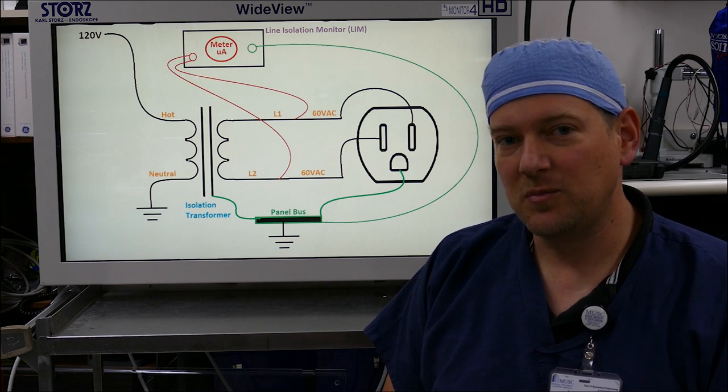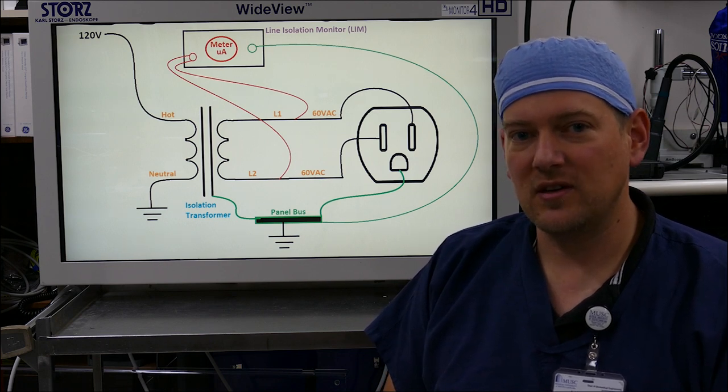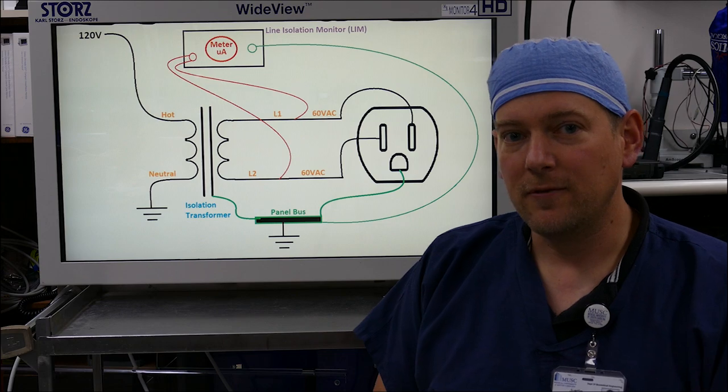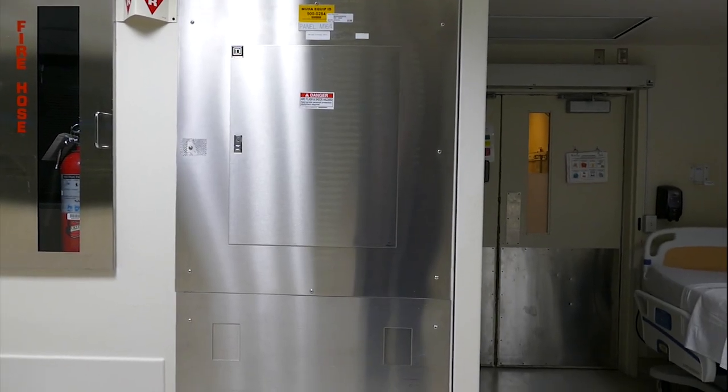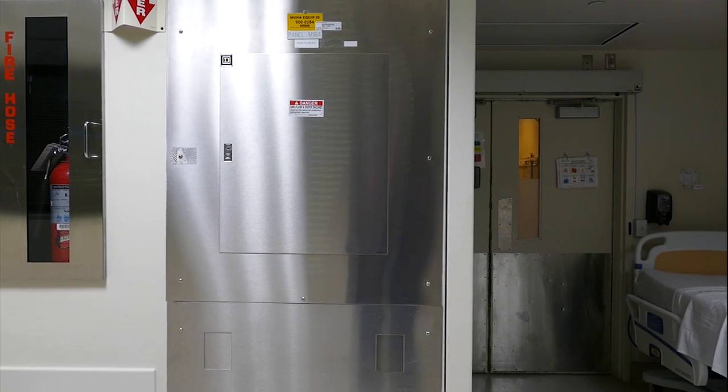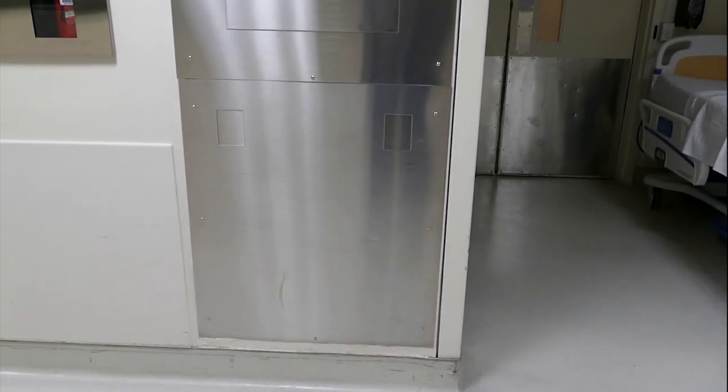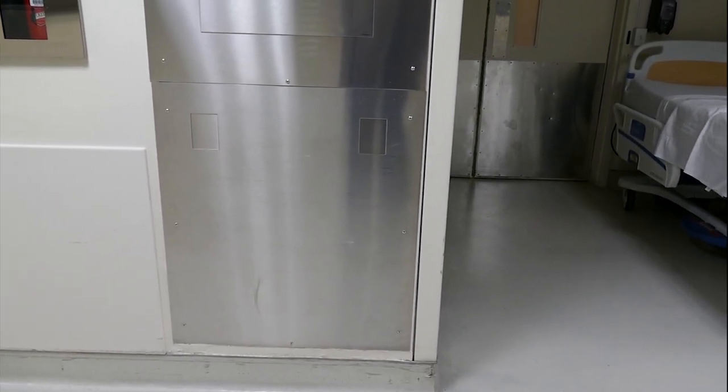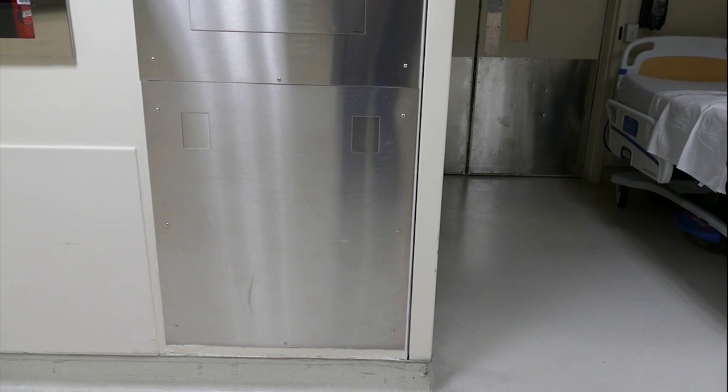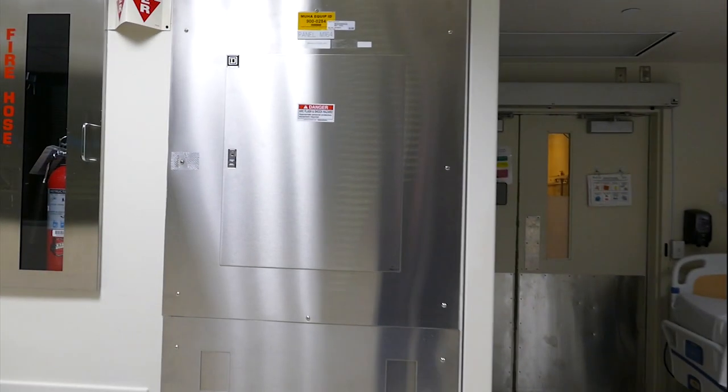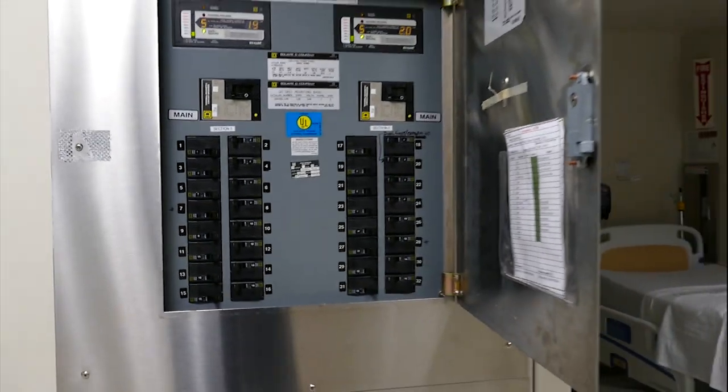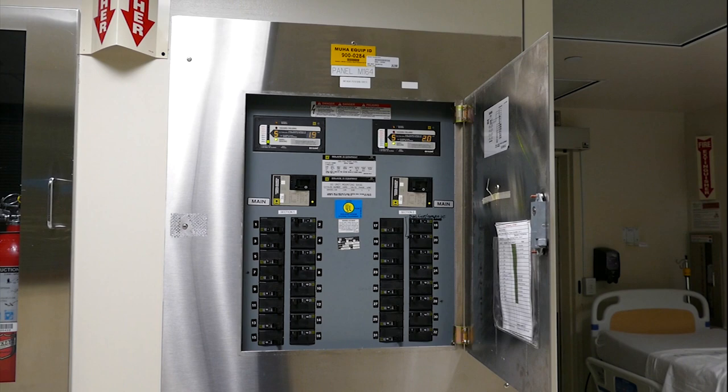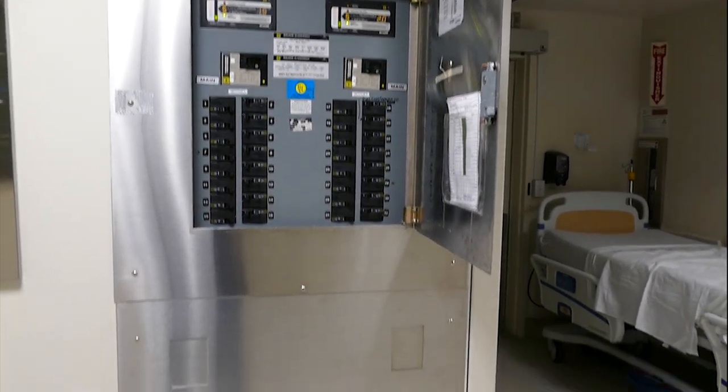Line isolation systems protect the users and the patients inside operating rooms from electric shock. This is a LIM panel, a line isolation monitor panel. Down here is your line isolation transformer. There actually are two transformers because behind the panel you can see we have two separate panels.